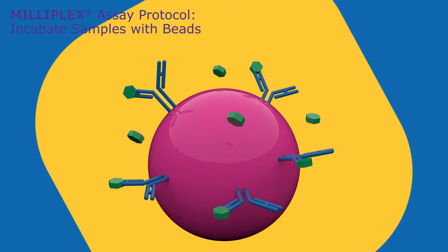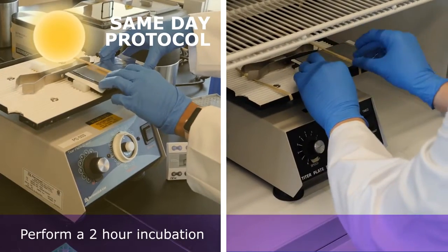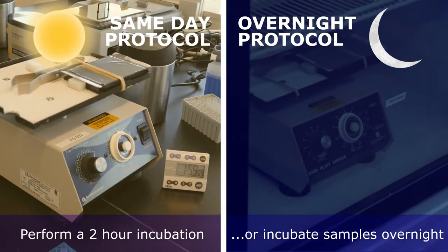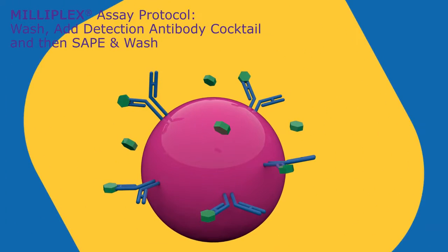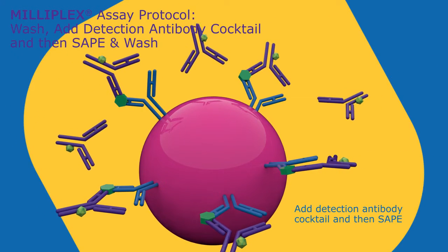When beads are mixed with sample, the analytes are captured by the specific antibody or antigen coating the bead. Perform a two-hour incubation at room temperature with shaking, or incubate samples overnight at four degrees Celsius to maximize sensitivity. Carefully wash beads to remove any unbound sample.